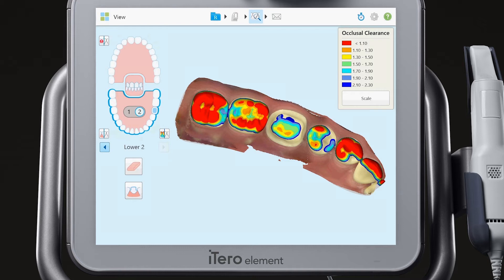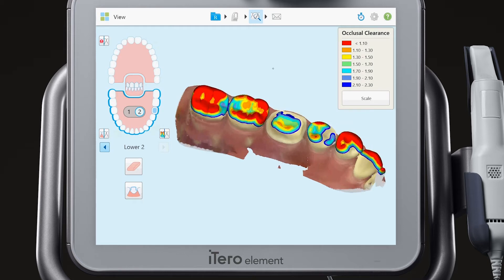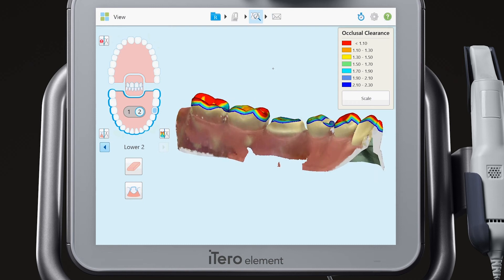Once the case has processed, evaluate the model of the prepped arch by rotating the model using the touchscreen and confirm capture of all required anatomy. Notice the occlusal clearance tool that demonstrates with a color map the clearance based on the material chosen for the restoration.